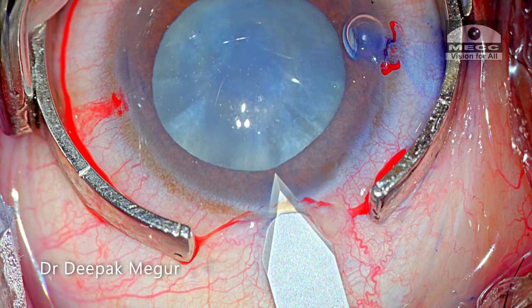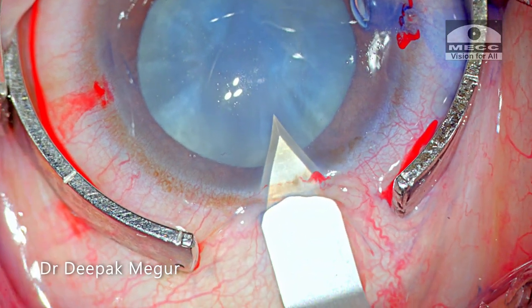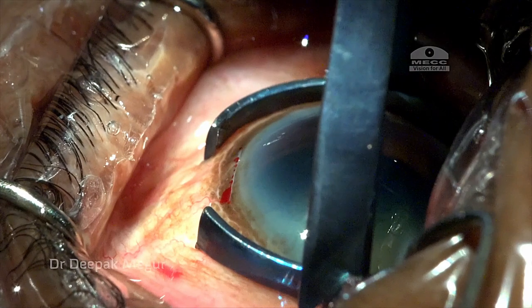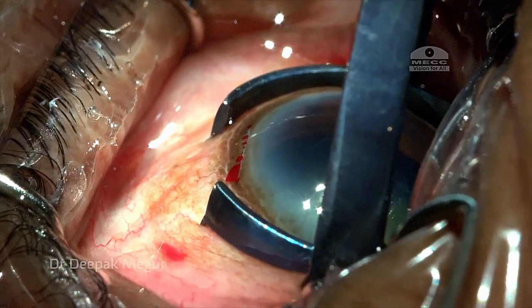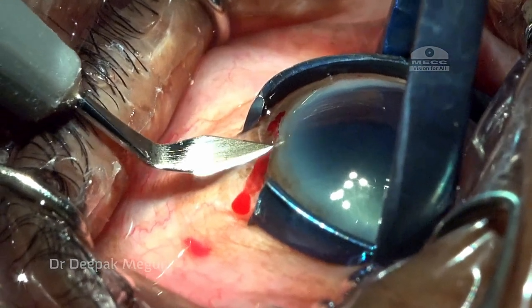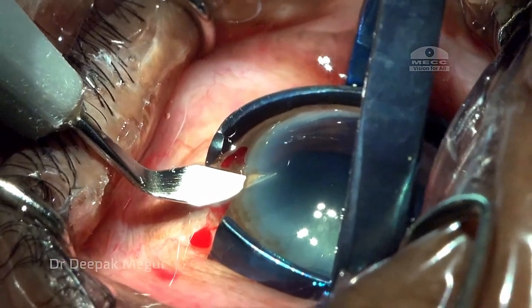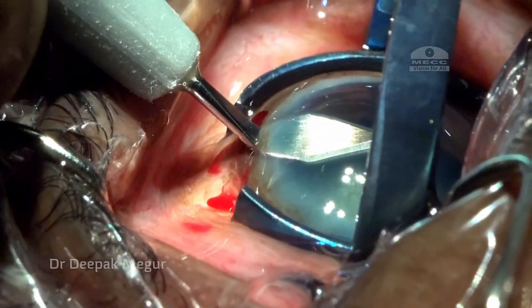We create an intercorneal tunnel of 2 millimeters, and then the direction of the blade turns just a bit so that the blade becomes parallel to the surface of the iris. Then it perforates Descemet's membrane. This is the configuration of the wound we have, and the inner lip is a nice straight line. The globe is stabilized with the fixation ring, and I turn the globe ever so slightly away from me so that I can create an adequate intercorneal tunnel.